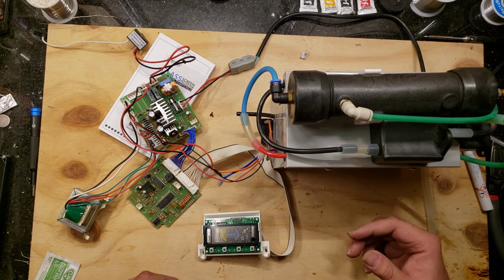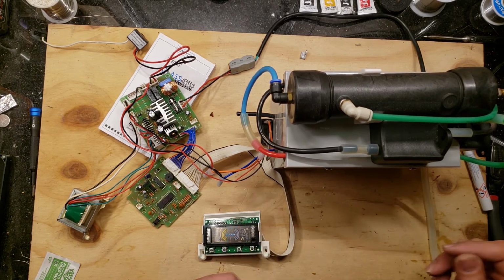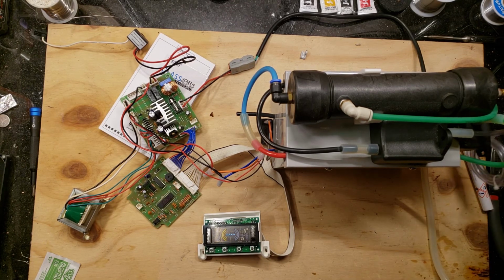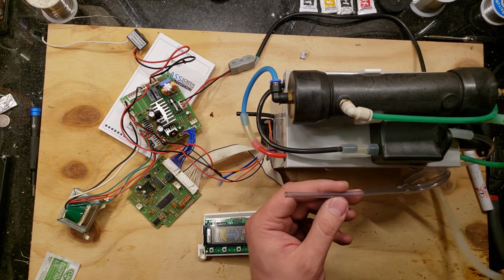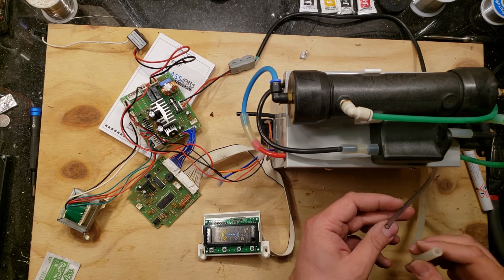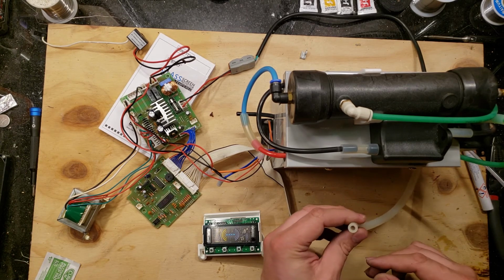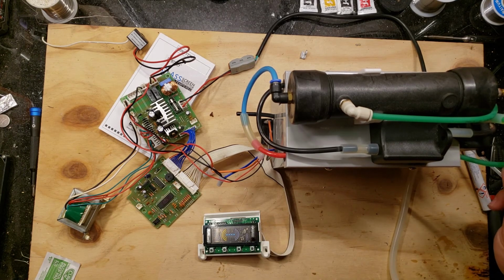So yeah, it does seem like a little useful little unit, and I will build it a nicer case that is more compact than the original one. And yeah, I'll probably do a better filter on the input than what's in here right now, and possibly do some kind of a filter on the output, because it does have that, you know, kind of a technical smell of the hose to it. I'll probably get some new CPVC hoses for this and make it all nice and updated.